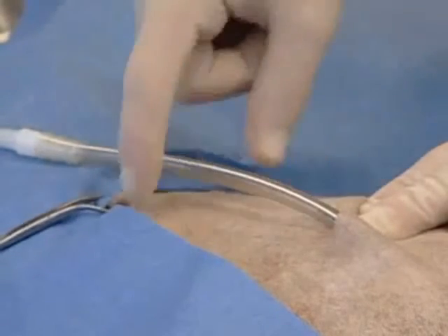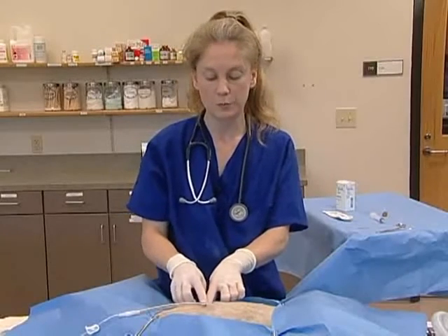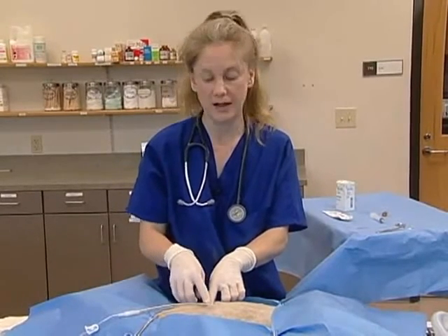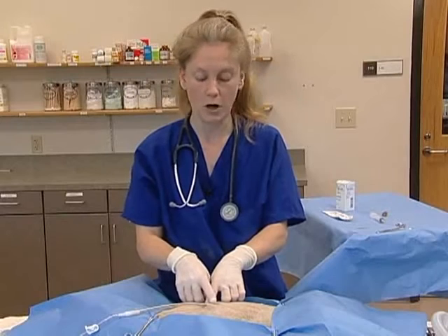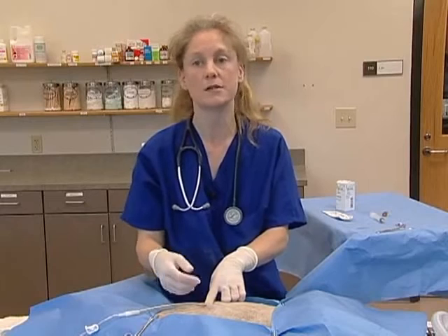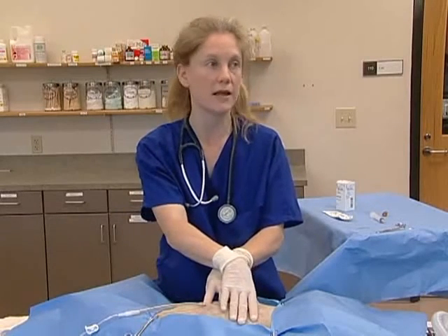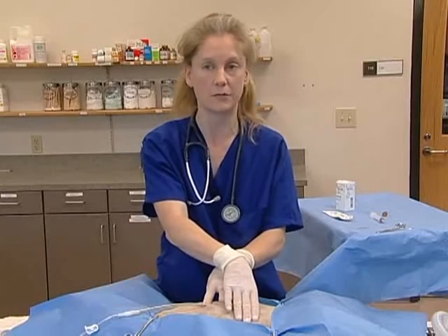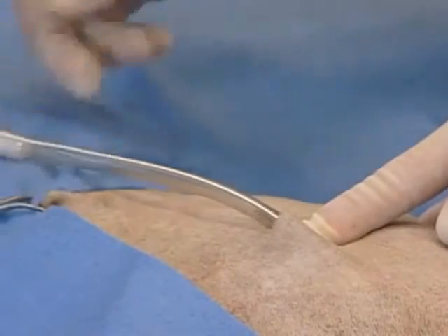In order to care for the tube, it's important to place triple antibiotic or some betadine ointment at the point of insertion. Lightly place a sterile Telfa or sterile 4x4 gauze over that site, and lightly wrap the body with some cling wrap and a little bit of elastic to secure the bandage to the cranial aspect of the thorax. Tape the tube to the vet wrap and then you're ready to go.